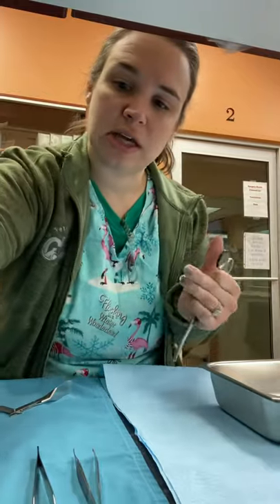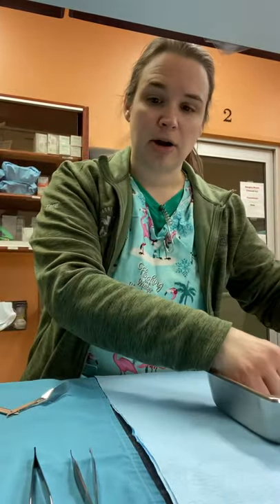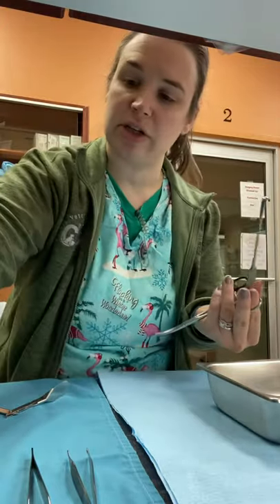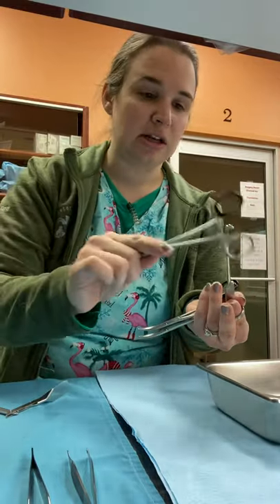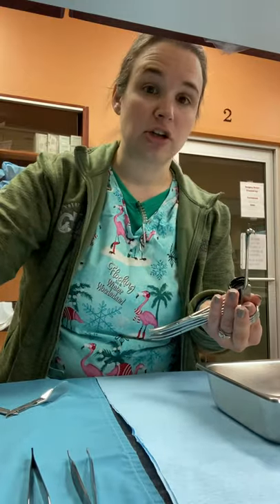We place our scissors closed in the bottom of the tray. We take the spay hook and go from largest to smallest, not closing all the way, not latched, and stack them into our spay hook to keep them ready for our doctors.